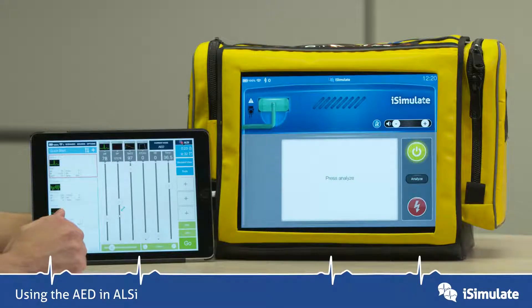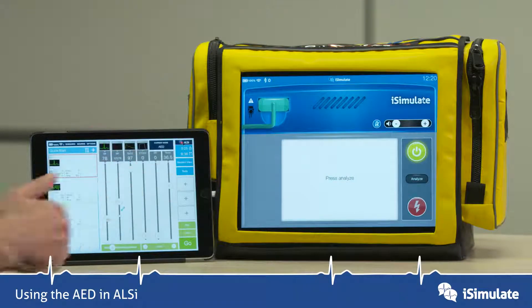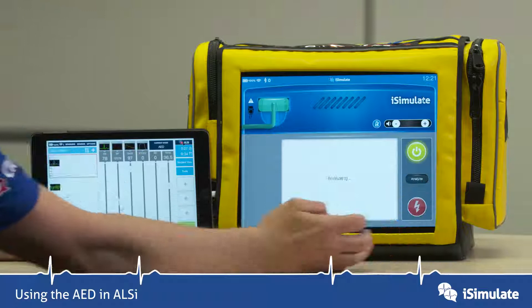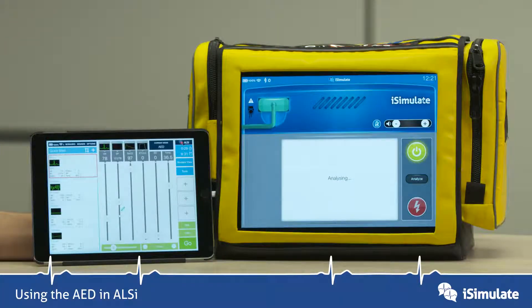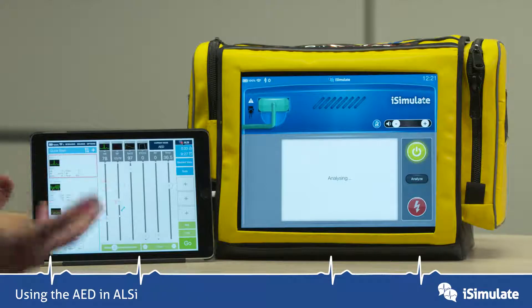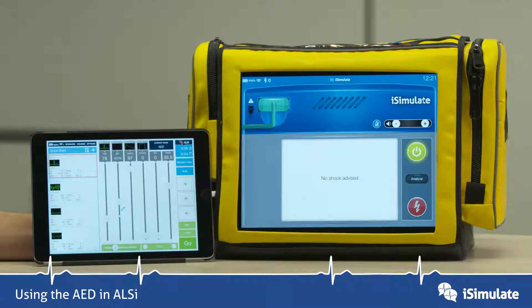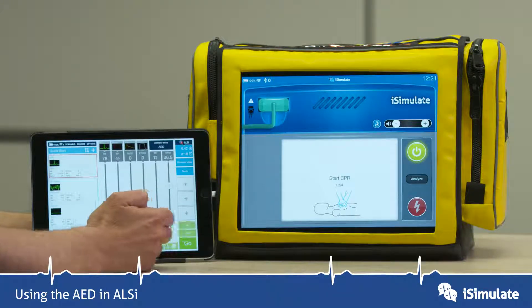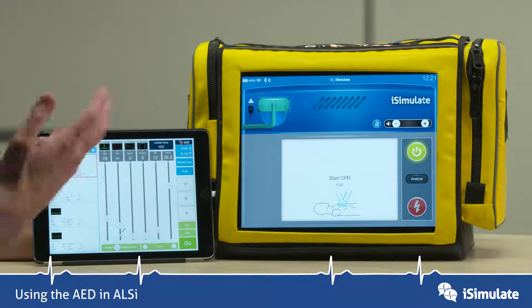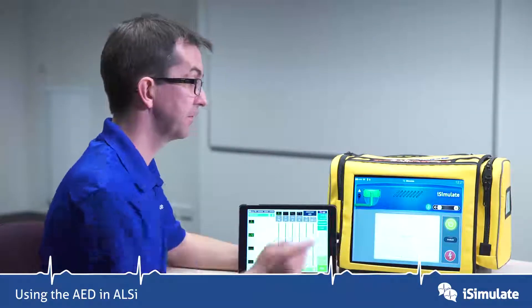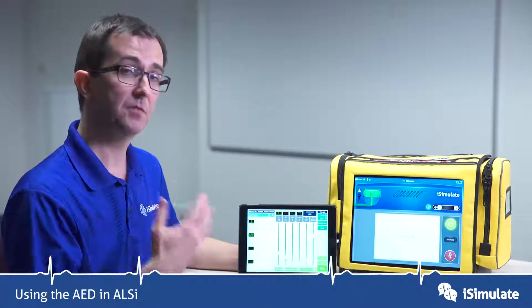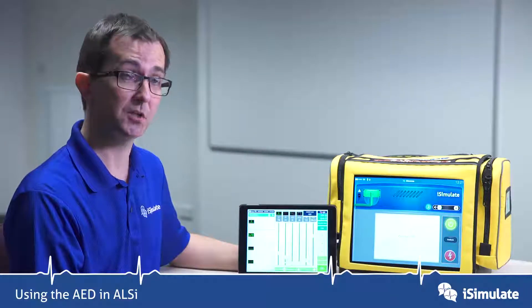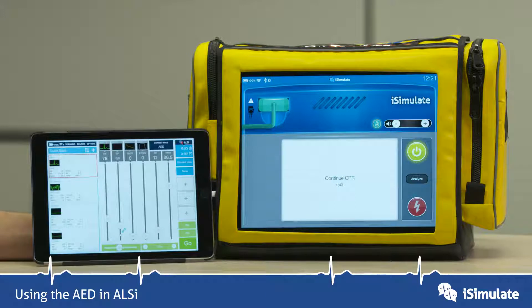Once we get into this, it will ask you to press analyze, so that's what we're going to do next. It's now analyzing a sinus rhythm, so we can start CPR, and as we start doing that we can also turn on the metronome. That gives a really good guide for compressions for the student that you can use for teaching.